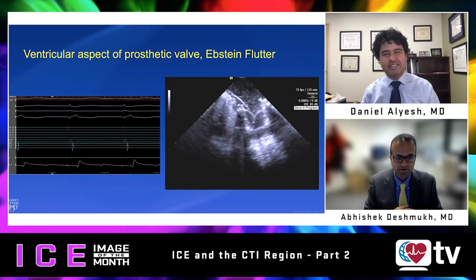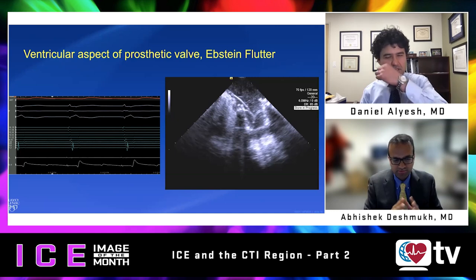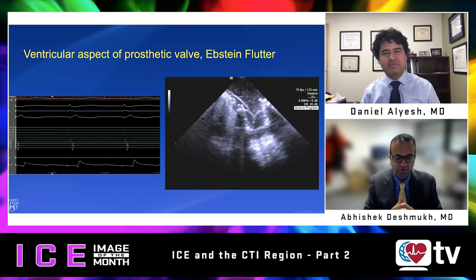Ablation at that atrial tissue resulted in bidirectional block in this patient. This case highlights the importance of understanding concepts of regional anatomy, biophysics of ablation, and intracardiac echo — all key for success in these more challenging ablations.